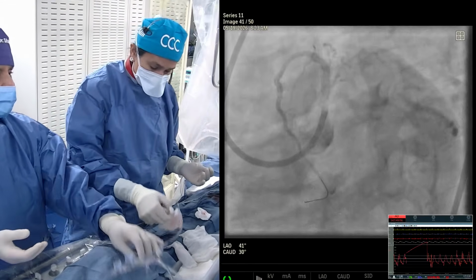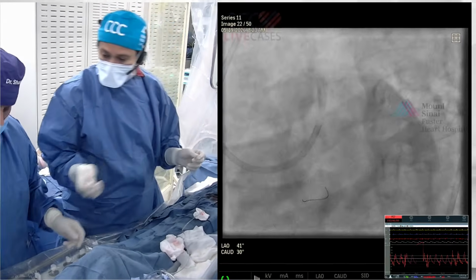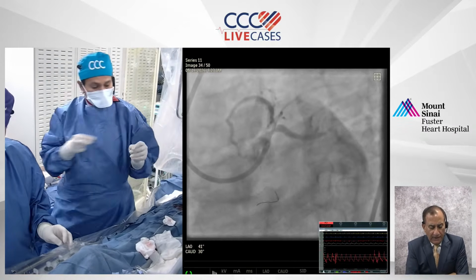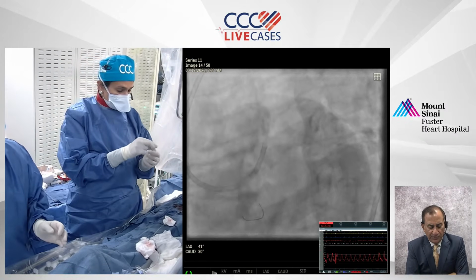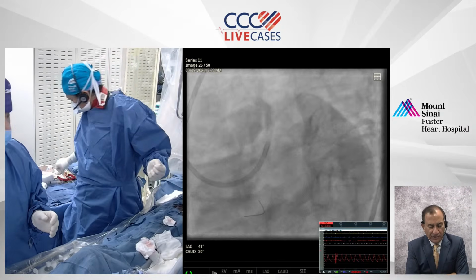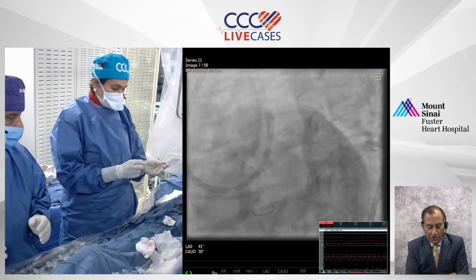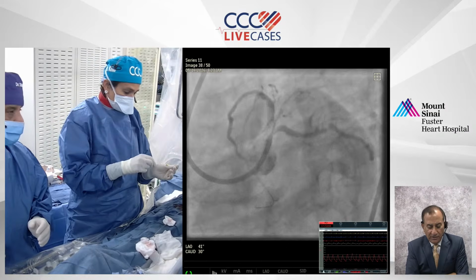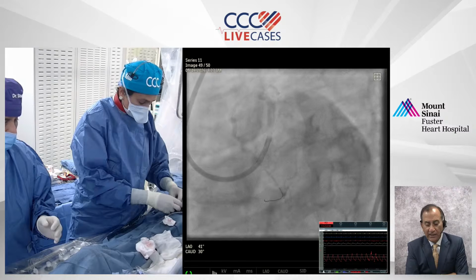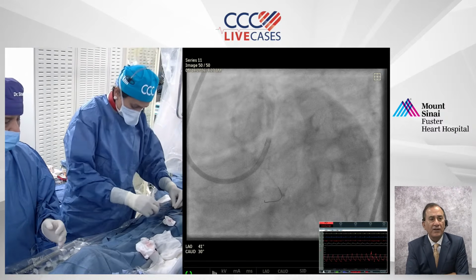All excellent questions coming in. Here is another very specific one from Dr. Mohammed. I know he's been with us several times before. I'll read it exactly as he mentioned. Of course, he first of all said, good morning, great team. Shouldn't you advance the burr while pressing on the brake defeat button and a second operator fixing the wire?